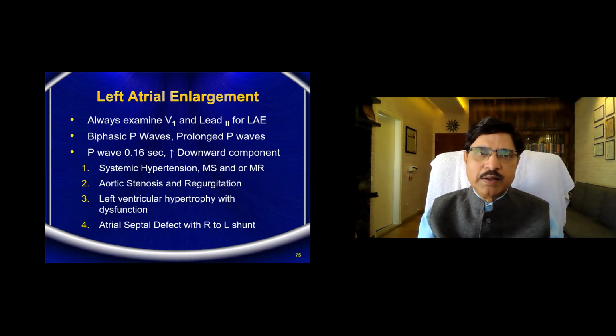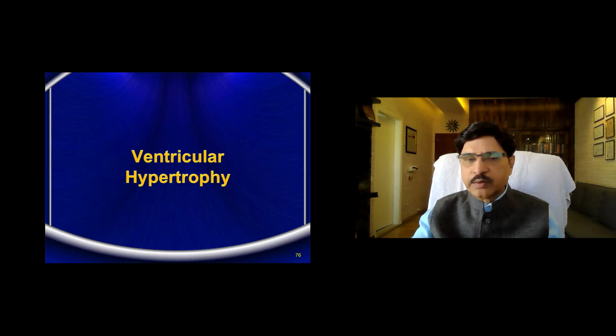Hope you have digested both left atrial and right atrial enlargement. Now we show you an ECG. Okay, we'll come to that. At the end of the session, I'll show the ECGs. Then let us enter into ventricular hypertrophy.